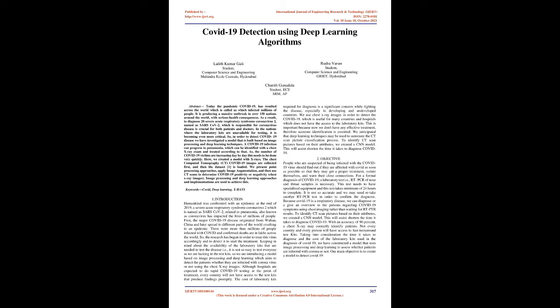So, the research has begun in order to treat this virus accordingly and to detect it to start the treatment. Keeping in mind the availability of the laboratory kits that are needed to test the disease, it is not so easy to test everyone as we are lacking in the test kits, so we are introducing a model based on image processing and deep learning which aims to detect whether patients are infected with coronavirus or not using the chest X-ray images.